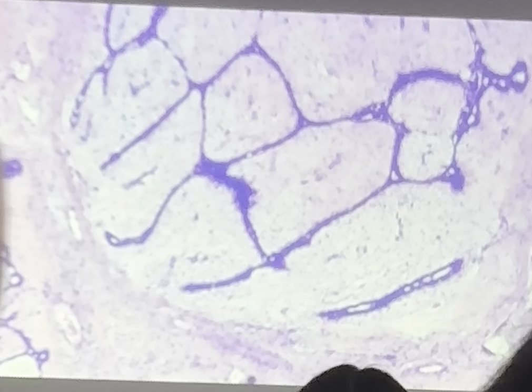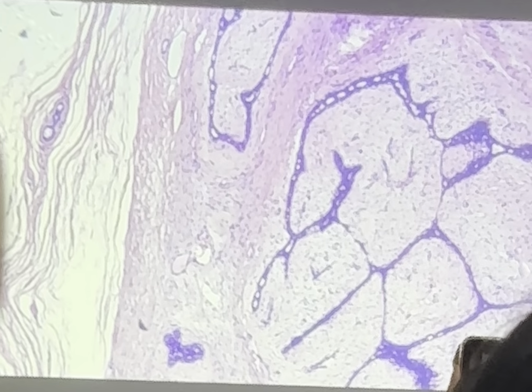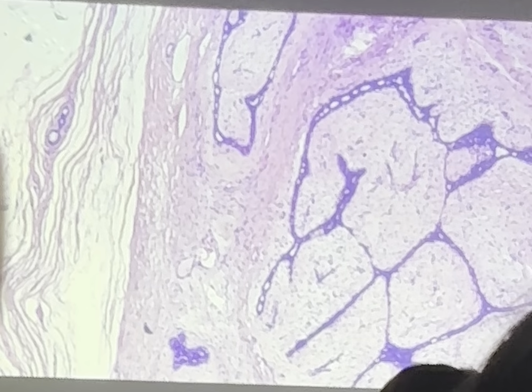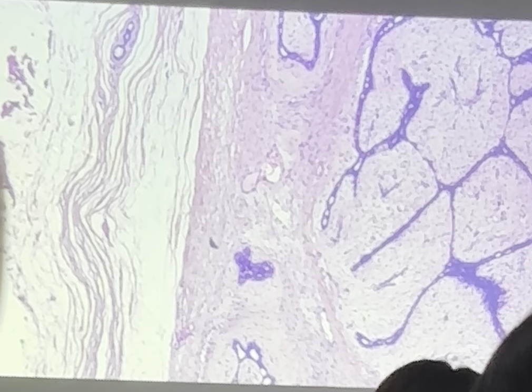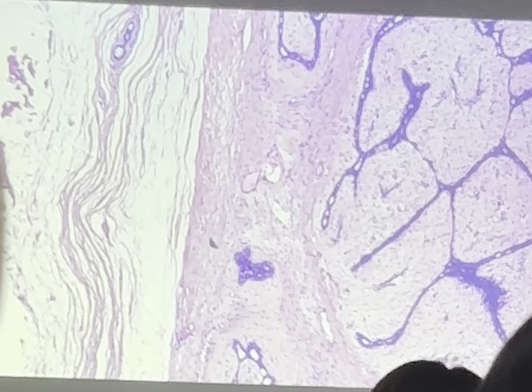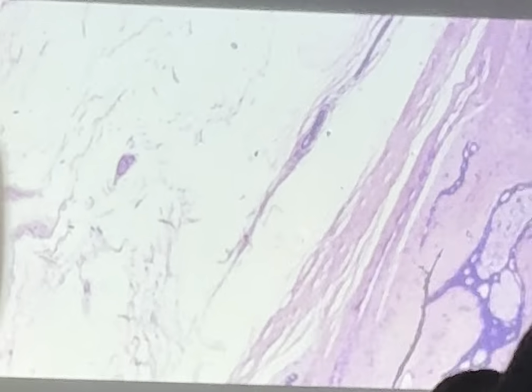Oh, I love this one. This is such a classic textbook picture. Unfortunately, this tissue has no normal tissue in here. So I'll just tell you that this is from the breast. Okay. It's forming a well-circumscribed mass. Here's the border of the mass. It's very circumscribed. Smooth borders all throughout. It's just going around. Very nice, smooth borders.